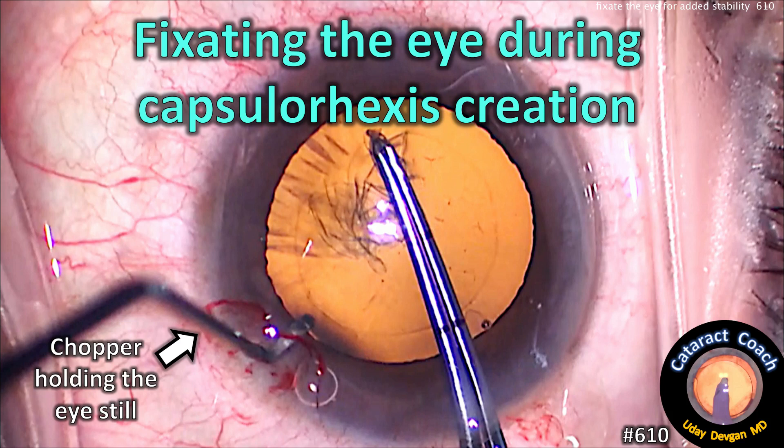CataractCoach.com. Fixating the eye during capsulorexis creation.